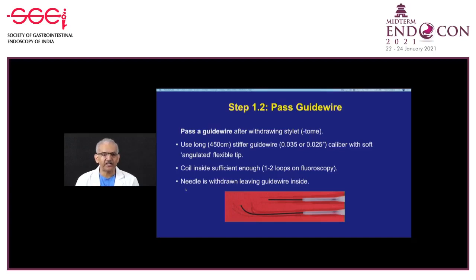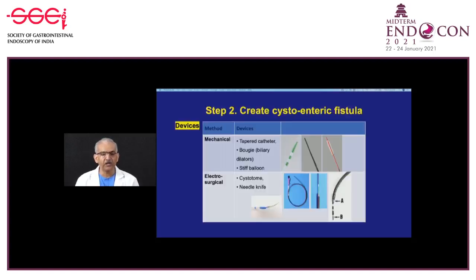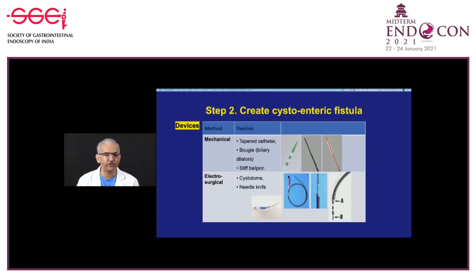Once the guide wire is well inside, withdraw the needle leaving the guide wire in place. This movement must be coordinated with the technician so the wire is not accidentally pulled out. The next step is creating a cystoenteric fistula, done either by mechanical dilation—using a tapered catheter, bougie, or stiff balloon over the wire—or by electrosurgical devices like a 6 French cystotome.